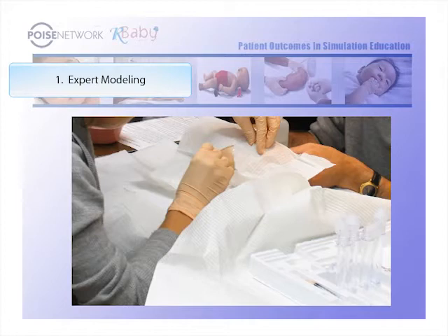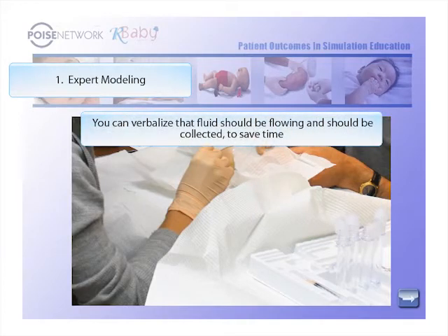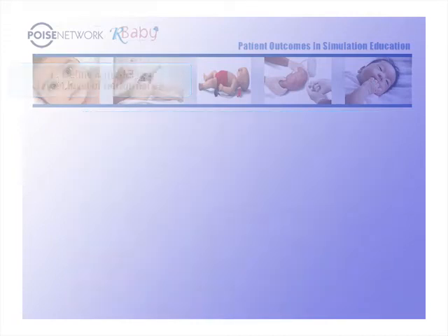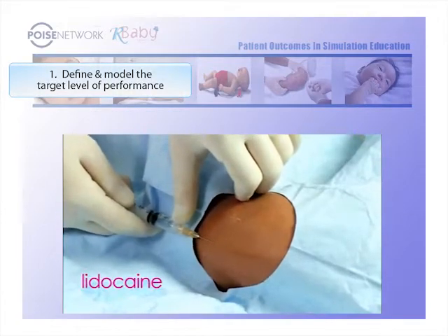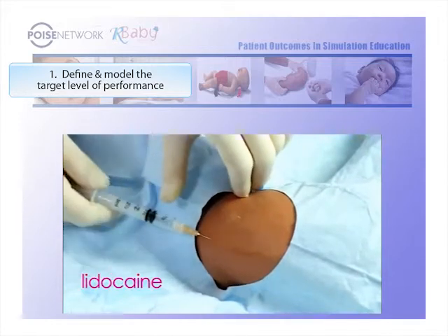Expert modeling should only take 1 minute. It is a quick demonstration of the complete procedure without actual teaching. Lidocaine cannot be used on the LP simulator, but you can use an empty syringe to simulate this step.